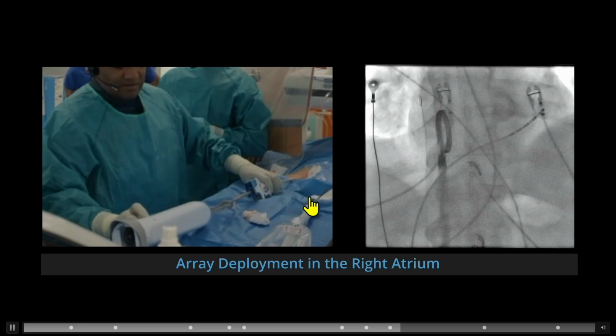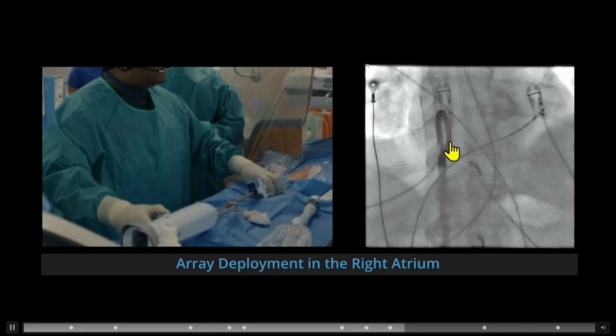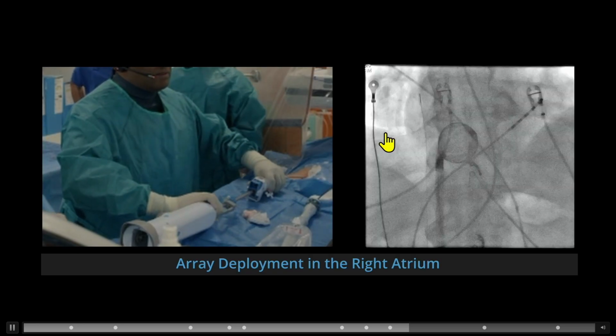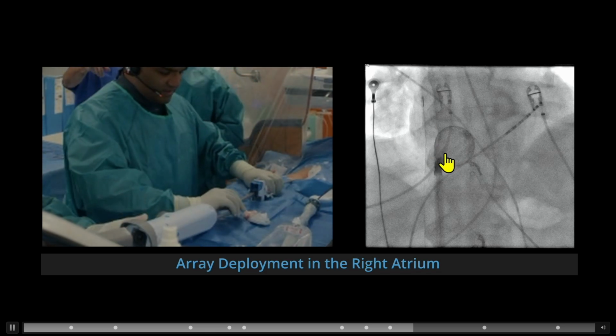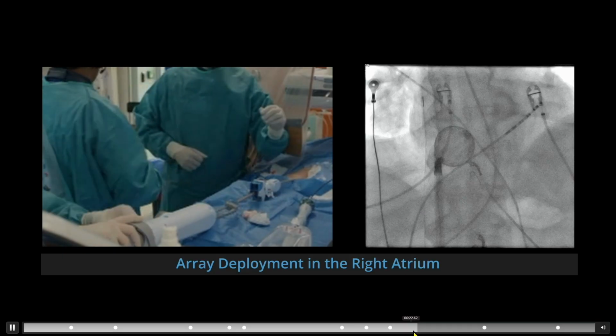Now we're going to go to the right atrium. So we pulled it back in the right atrium. We deploy this. So as you take it out, I tend to point it laterally, toward the lateral right atrium. Then we open it up, and now it's deployed into the sphere. And then we can deflect it.